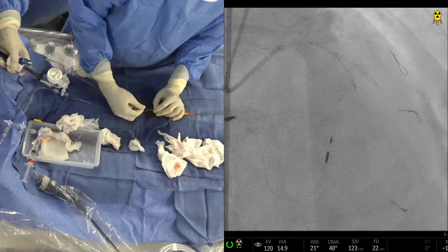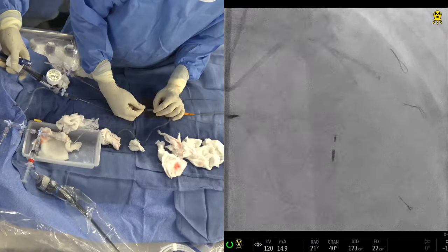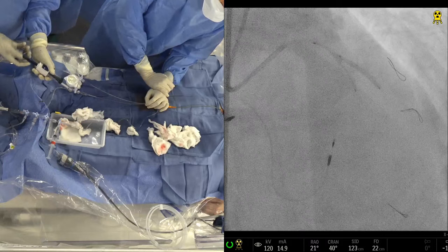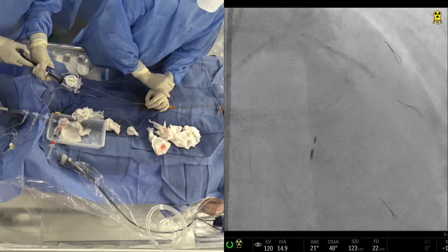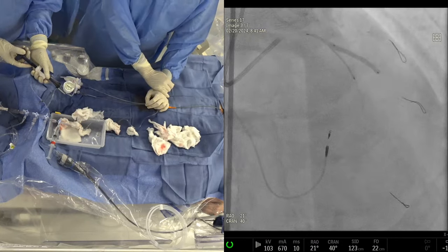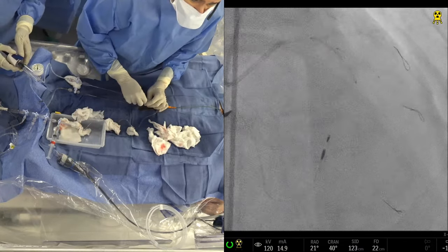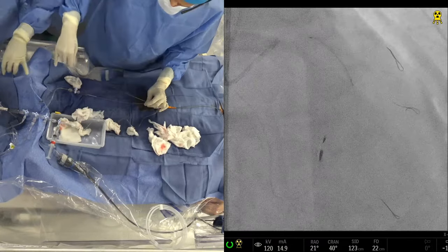The question was that if you put a stent, you have to have a position in the main vessel, because if the stent is a little bit pressed, crushed by the side branch, you'll not be able to move the stent. So that's why we wanted to have this position. Go up again. Okay, good. Then 3.0 by 15, the stent. 2.75 or 3.0? What do you want for the D1? 2.75 by 15. And the wire out.